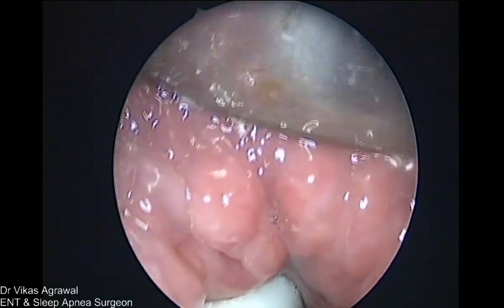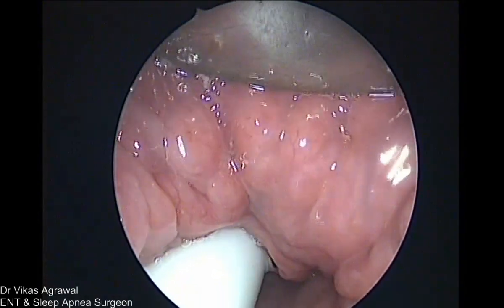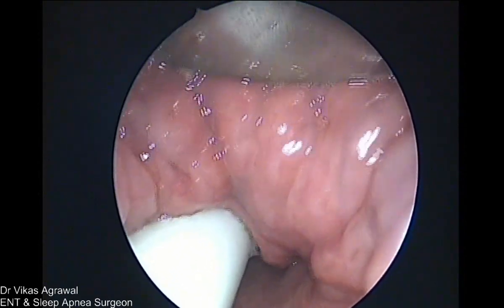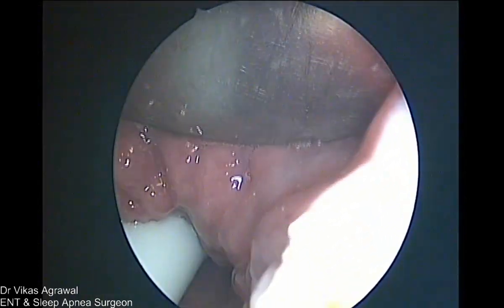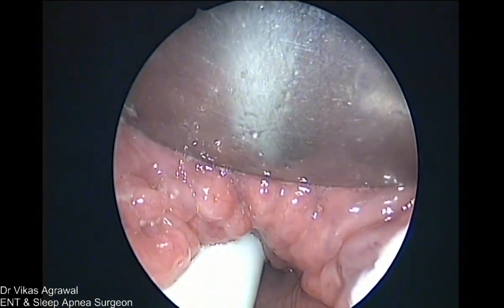So I am a little too inside. Anyway, I'll start from here. I have to come up to the foramen cecum, but I'll start from here because this is a little big tongue base. Let me start. This is correctly placed. This is a little big mouth gag, so the blade is little big, but let me start from here.